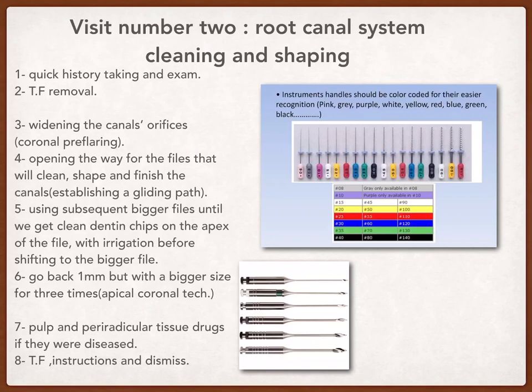The instrumentation and the cleaning are very important, but because we use the rotary systems now, we are not totally sure that every single part of the root canal system is totally cleaned and shaped.